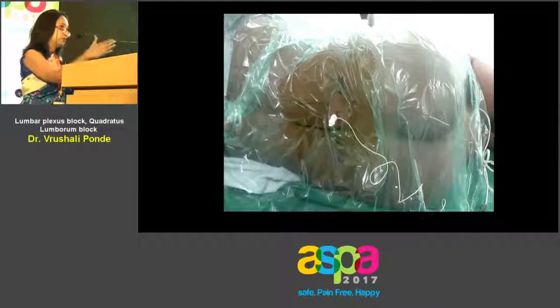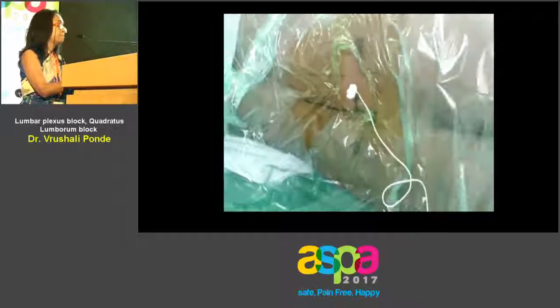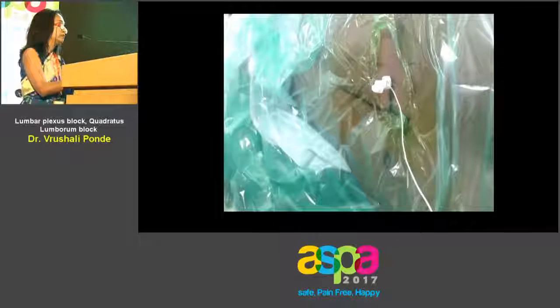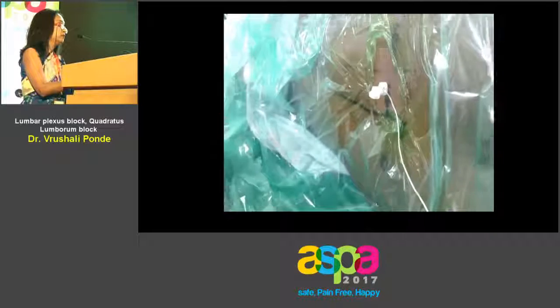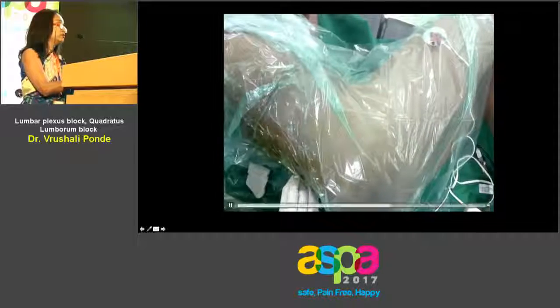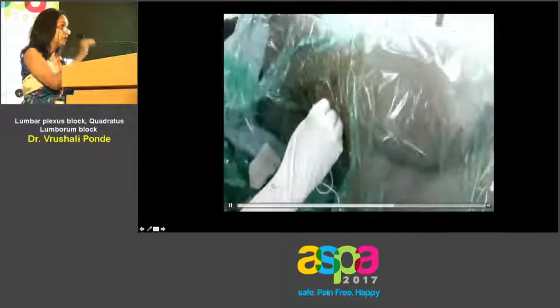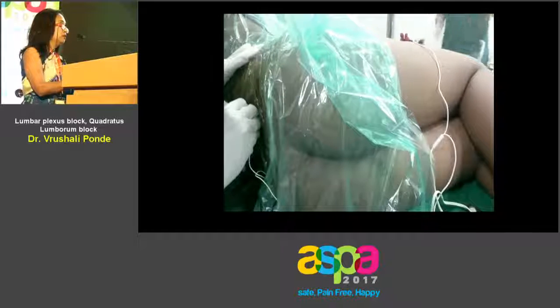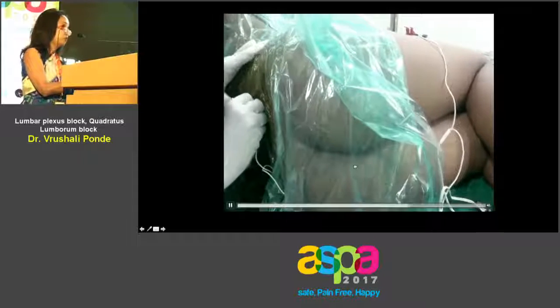It's in the deeper muscles of the back, such as the erector spinae. Or the psoas muscle itself can throw these contractions. But then we are not at the plexus as such. These are the posterior responses which we would like to ignore.